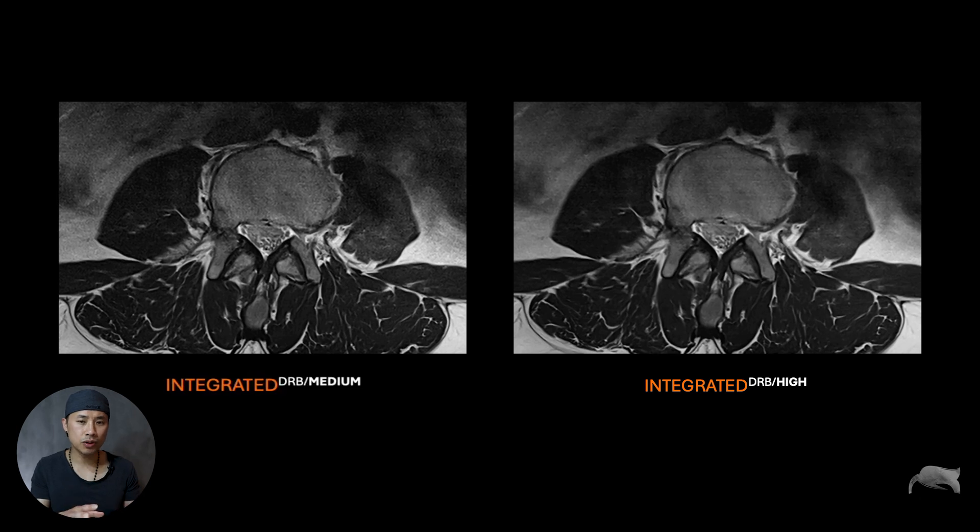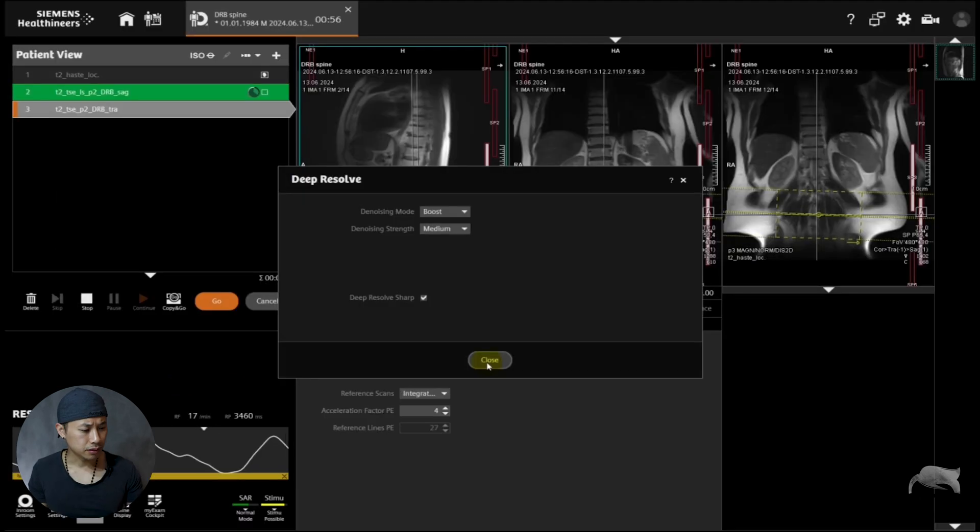So this is the difference. We are using integrated mode, and both scans are exactly the same — I just did a retrospective reconstruction with Deep Resolve hard on, just to show you. As you can see, this is medium — it's a little bit noisy, which many radiologists like. But for integrated hard, you can see it's a little bit smooth, and there are some artifacts: streaking artifacts and smearing artifacts, which is not great at all. It's also too smooth. That said, it depends on your radiologist's preferences. I personally like the medium because it's a little noisy — it's more like what we're used to.